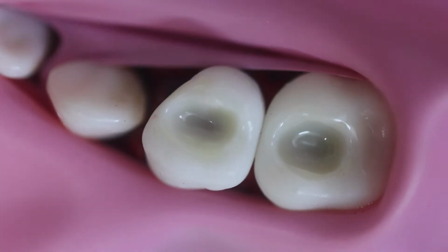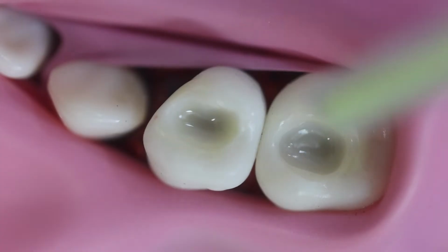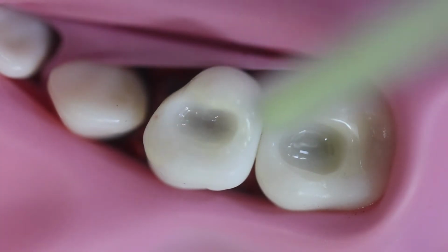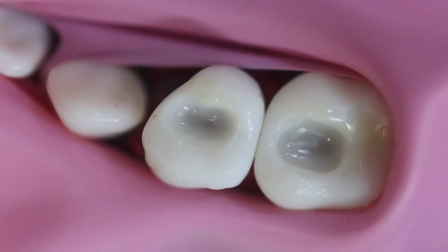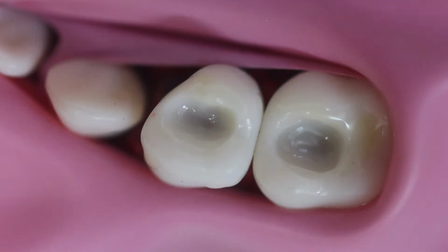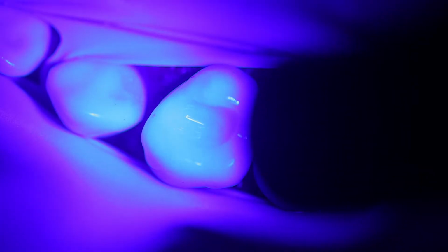Once applied, use your 3-way air, first slowly for a few seconds to let it spread uniformly, then fast. Let it spread uniformly inside the cavity, and this is the time you may light cure it. Light cure it for 30 to 40 seconds as per the manufacturer's instructions.